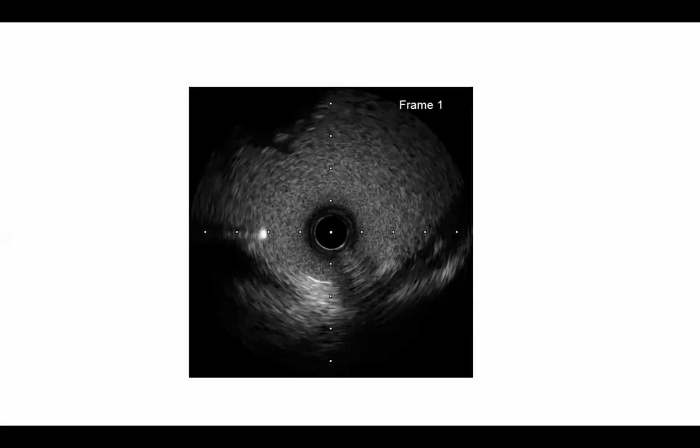One question that's come up twice now is, was this diagnosis of shock complemented by arterial blood gas and lactate levels? So at this very time, we hadn't done the gas yet, but as is the case with most of the STEMIs, we usually do a blood gas at the end of the case when the nerves are a bit more settled. So at that time, we didn't have the pH or rest of the things. We were just getting on with the case.